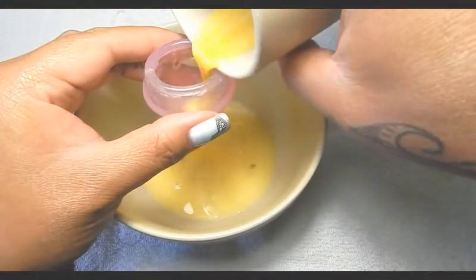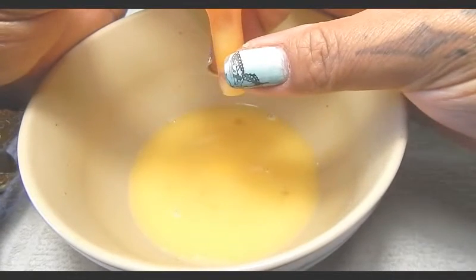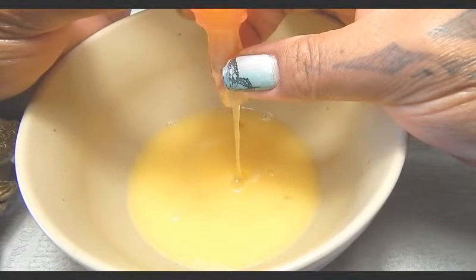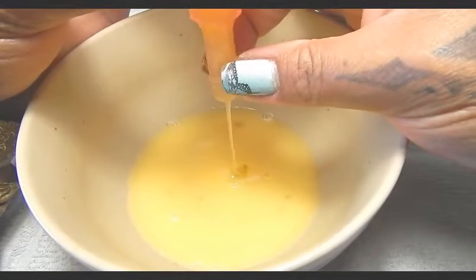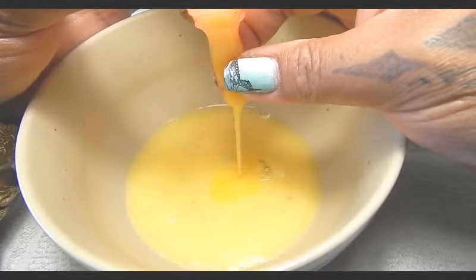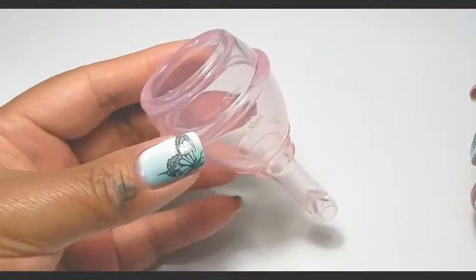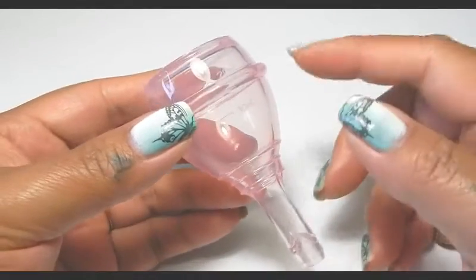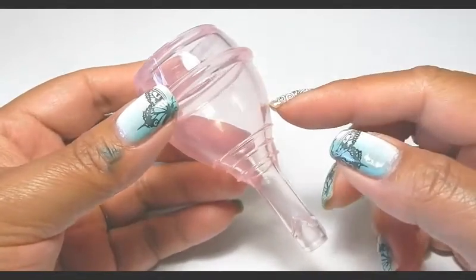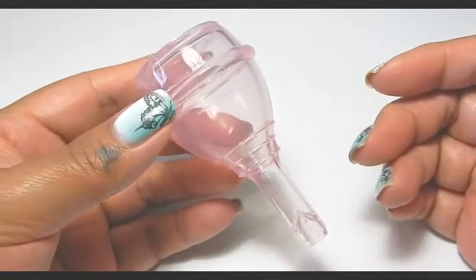Someone with a heavy period would probably want to pass this cup up. If you couldn't empty it often enough, this cup doesn't have a whole bunch of capacity — it equals probably the same as one of the smaller cups on the market or a small size of any cup on the market.